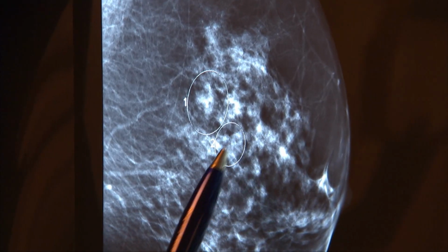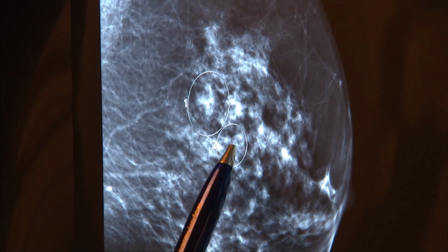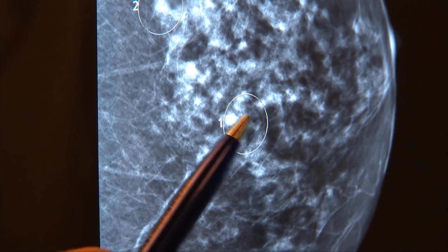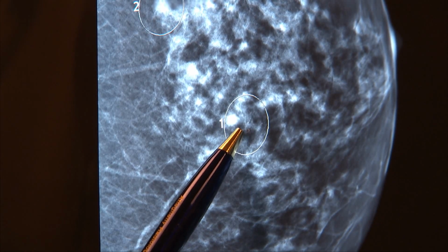And on the lateral, this is the MLO projection. They're sort of behind the nipple, and there's some smaller ones and some more clumped ones. And then on the craniocaudal projection, they're just a little bit in the inner aspect of the left breast. Again, this is a new cluster of somewhat pleomorphic calcifications, left breast, 10 o'clock.